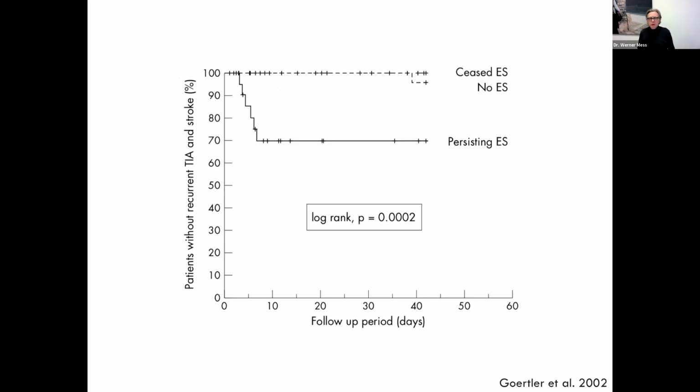Actually, there has been another study performed earlier, and they found more or less the same. So no new events in the embolus negative group. And they actually did repeated measurements, so this is why we have "persisting" here. But in fact, or essentially, it is the same.